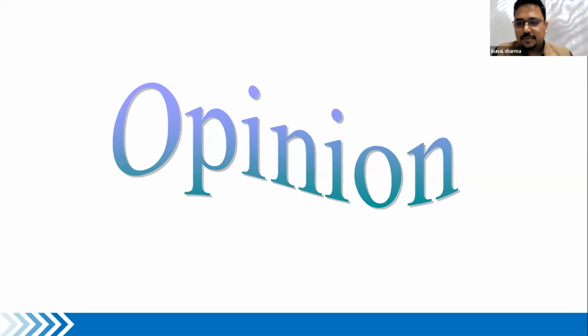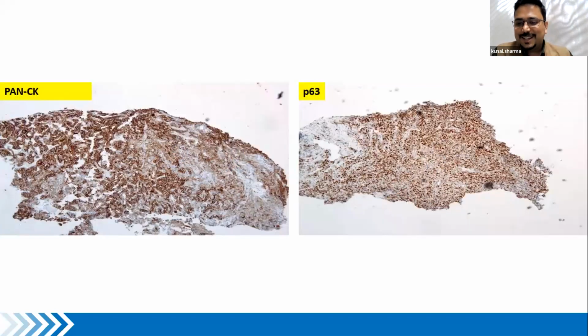I'll just share the primary IHC panel that we did. Interestingly, this case was positive for pan-CK and it was positive for P63. One of the primary differential diagnoses which I had from another laboratory was a sarcomatoid carcinoma. So have we made the diagnosis? Looks like sarcomatoid carcinoma. Yes, it does. And should we stop on these IHC markers? I usually tend not to.